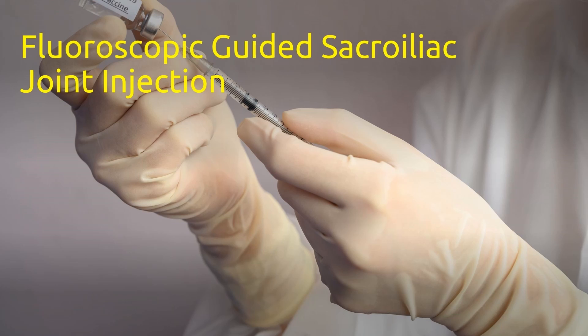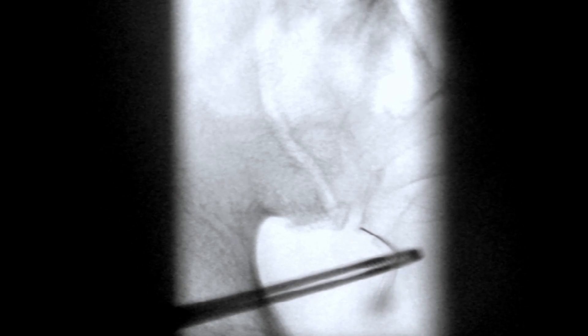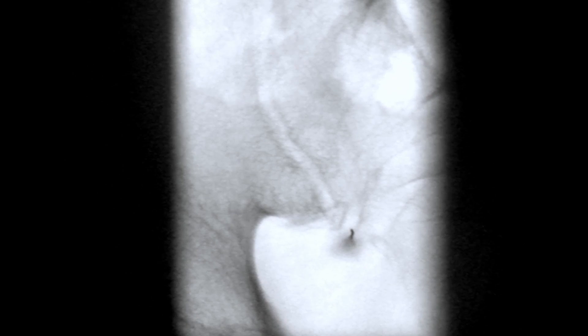I will share eight fluoroscopic guided sacroiliac joint injection cases in this episode. No single historical, physical exam, or radiological feature can definitively establish a diagnosis of sacroiliac joint pain. Therefore, based on present knowledge, a proper diagnosis can only be made using controlled diagnostic blocks.